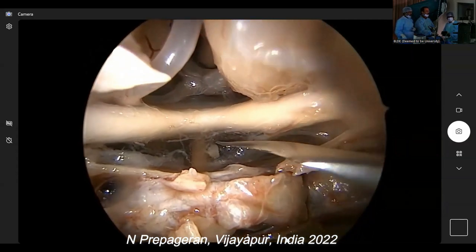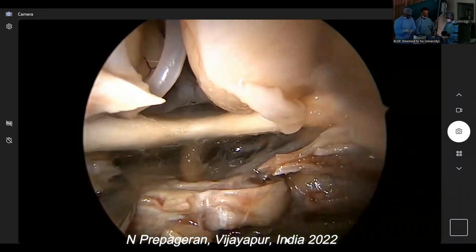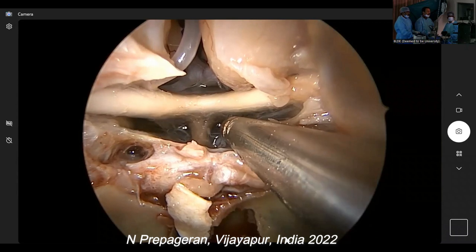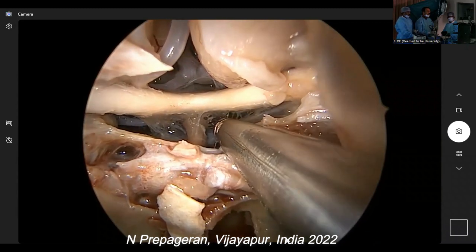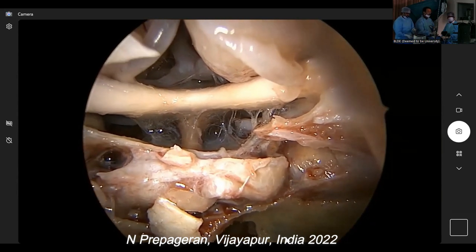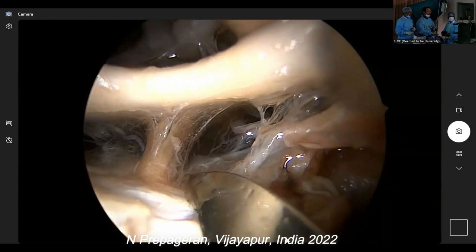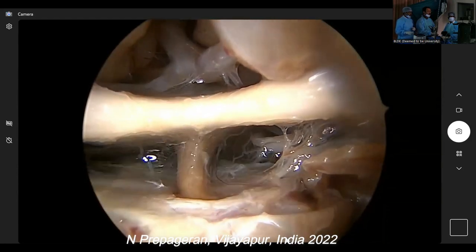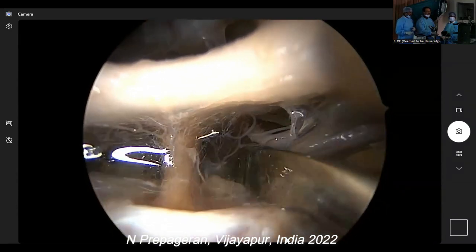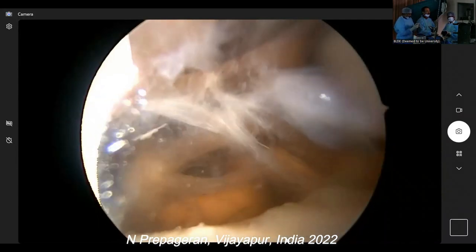Now, if we go between these two. Sickle knife again. These are all the arachnoid membranes. This is the membrane of Liliequist. You know Gulliver's Travels? Lilliput and membrane of Liliequist. If you remove this, you can see the basilar artery down there. The membrane there? There, basilar artery. Can you see, guys?